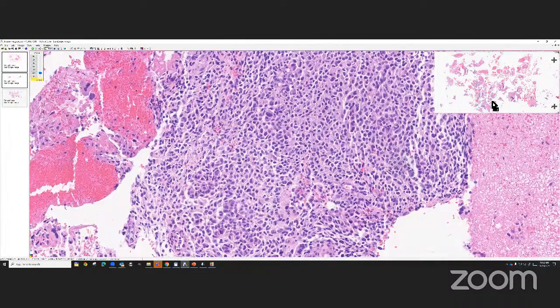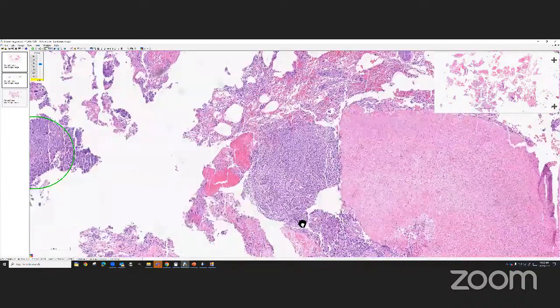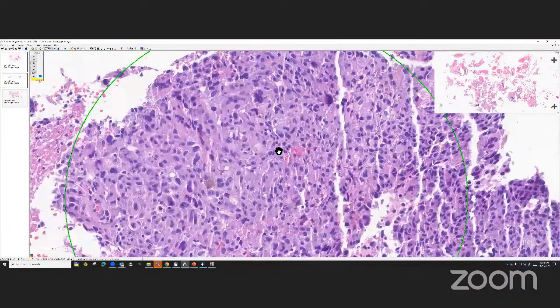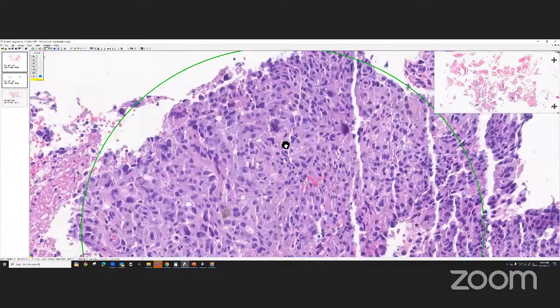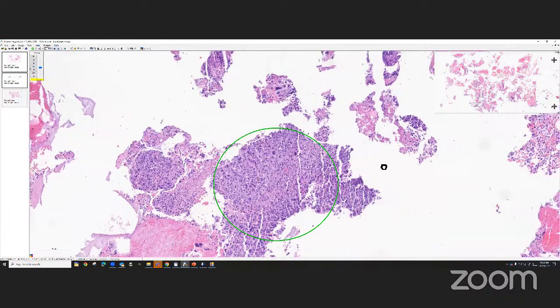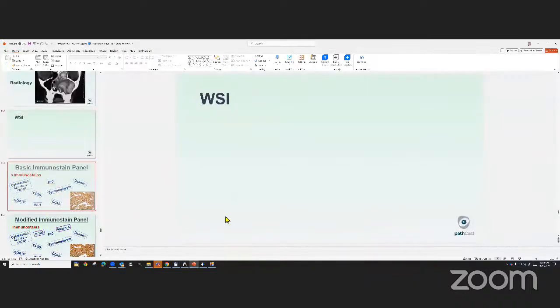Okay. And so other clues. Well, if I'm worried about melanoma, I always try to look for pigment if I can find pigment anywhere. And very, very focally in this tumor, there's maybe a little bit of a suggestion of some pigment here. I think there was a little bit right there, just a very little bit. And some of these big, uglier multinucleated cells. But you can see here's a big, huge nucleolus there. So some clues that this might be melanoma, but again, that might be hemosiderin. You can't tell for sure. It's not like obviously pigment. But those are some of the clues that we had on the H&E.